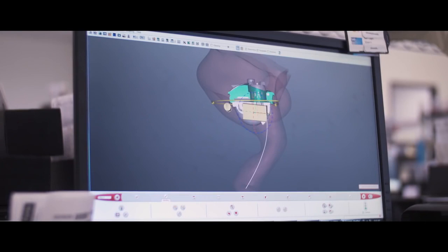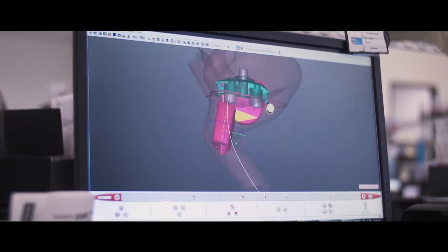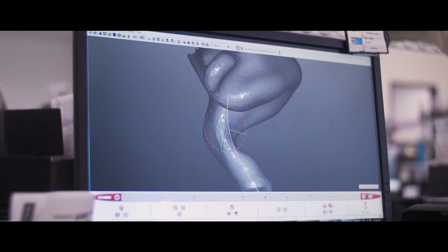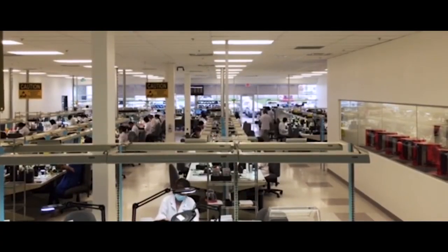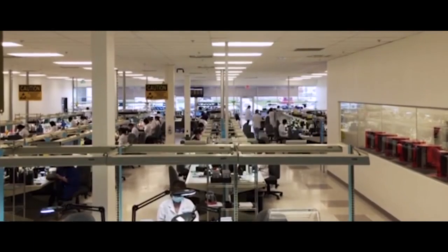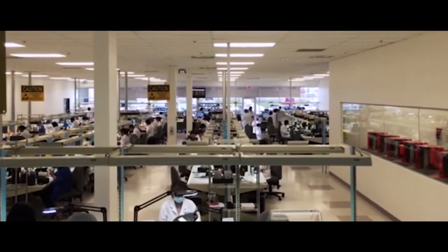We take the order form and all the customer's requests from order entry. That's including the vents, AOV, and our new digital locks. And we can see whether or not these components are going to fit, and we can give the customers what they request. We have to look at how our teammates down the line, are they going to be able to case the hearing aid? Are they going to be able to wire it based on the schematics that we design in RSM? We have to look at the end product.